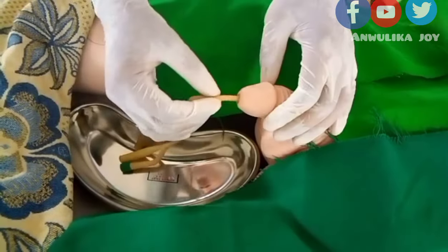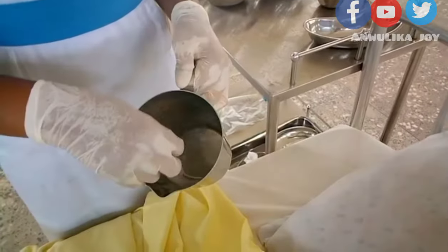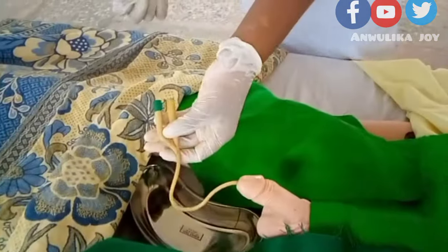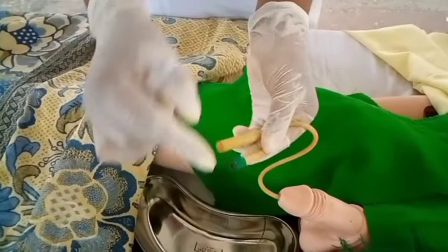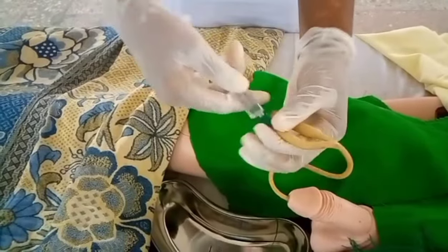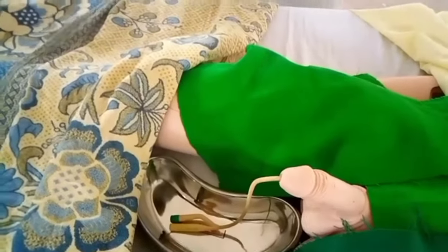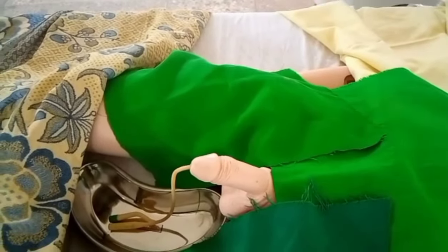If you want to obtain a urine specimen, this is the point to do so. If not, withdraw 10 ml of sterile water and inject it into the balloon port of the Foley catheter to keep the catheter patent and in place, so that even if the patient moves, the catheter will not pull out from the penis. Make sure you use exactly 10 ml.